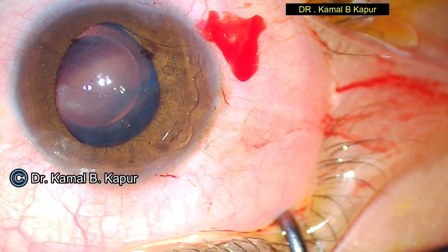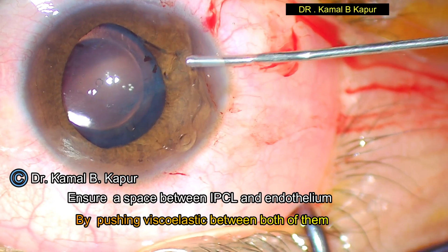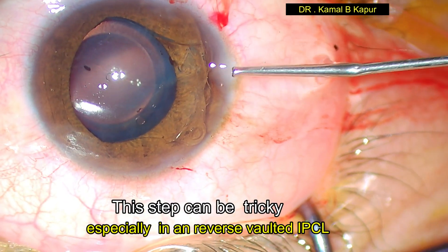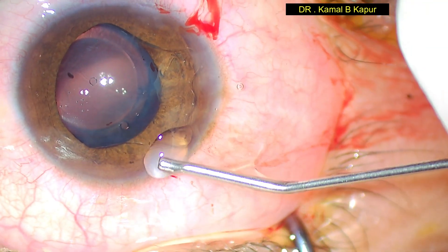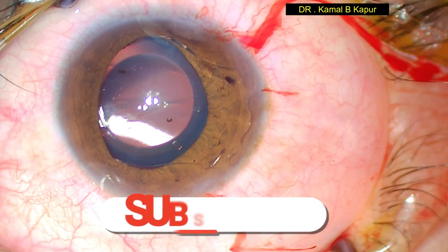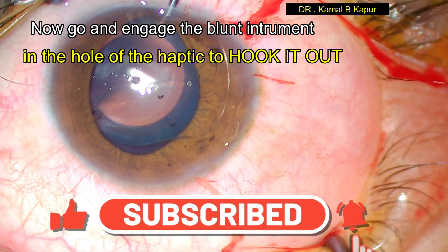We instill viscoelastic on top of the IPCL to separate it from the endothelium so as to avoid any endothelial damage, and also place some viscoelastic behind the phakic lens, because during explantation I don't want the phakic lens to rub against the crystalline lens or the anterior capsule.